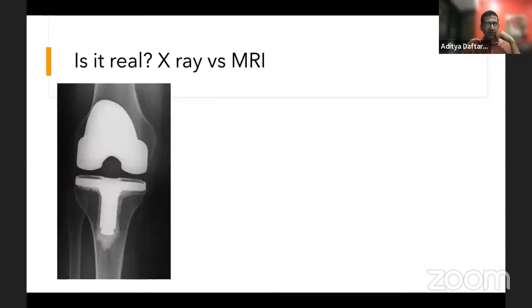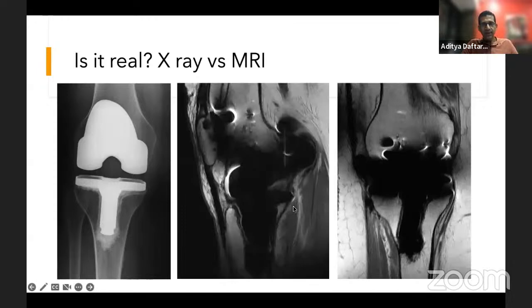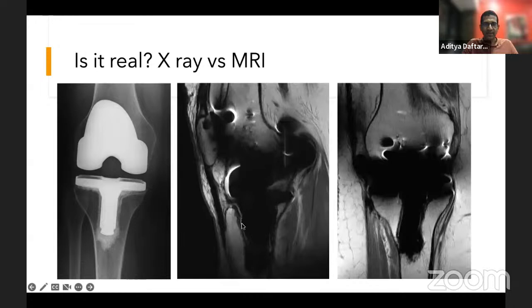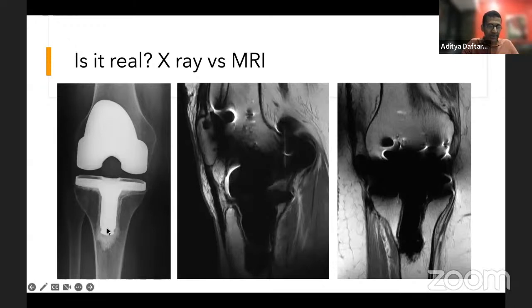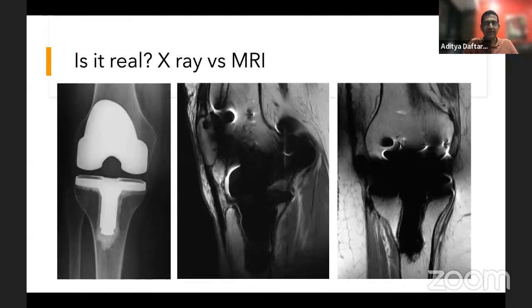Here's a patient with subtle subsidence of the tibial stem. On MRI, there's gross subsidence with a clear fluid cleft between the cement and prosthesis inferiorly — clear loosening of this prosthetic component. This is a nice example of loosening that's hard to pick up on X-ray from positional abnormality alone, but the MRI clearly identifies the loosening.